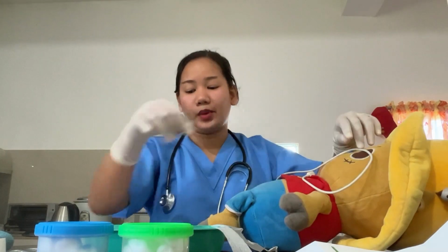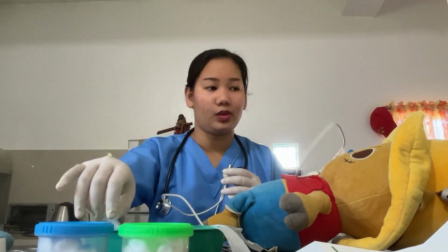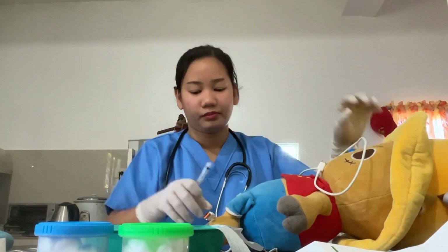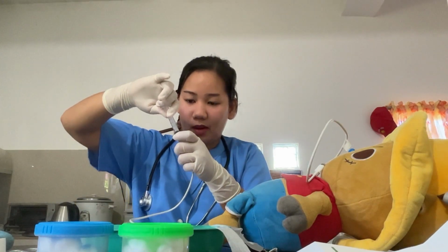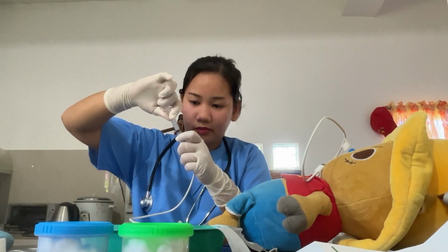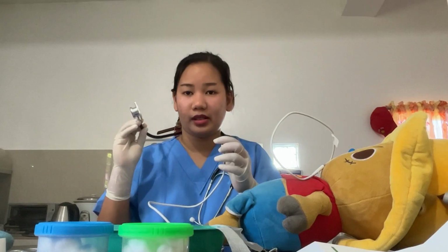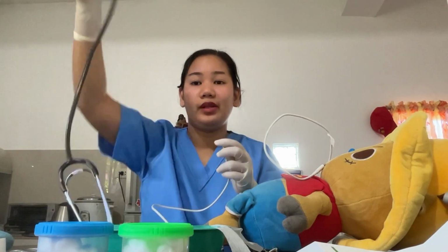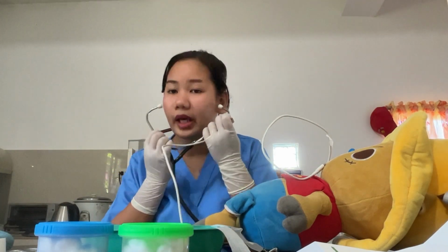So, I am going to aspirate some stomach contents to check the placement of this tube. And then, after that, I will use this stethoscope and inject 20 to 30 ml of air and listen for a whooshing sound.